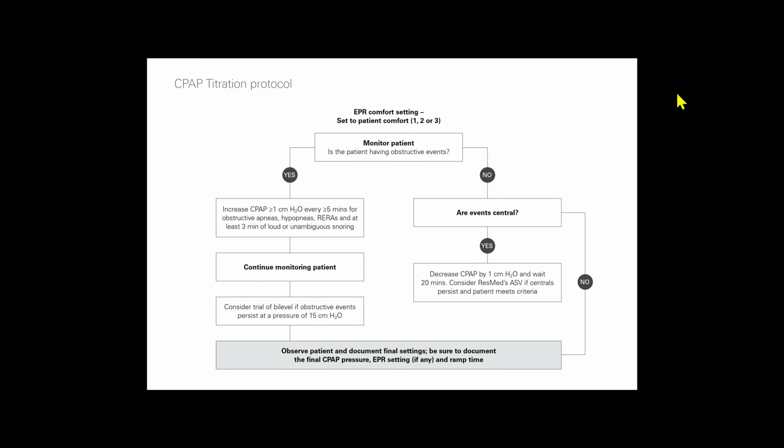This video is centered around how to adjust your CPAP settings. If you were to go for an in-lab sleep study to figure out what CPAP settings would work for you to resolve your obstruction, this is what the technician who's tasked with finding that would do while you were sleeping. These are the general guidelines. There is some variance between technicians, I'm sure, but this is what ResMed suggests.